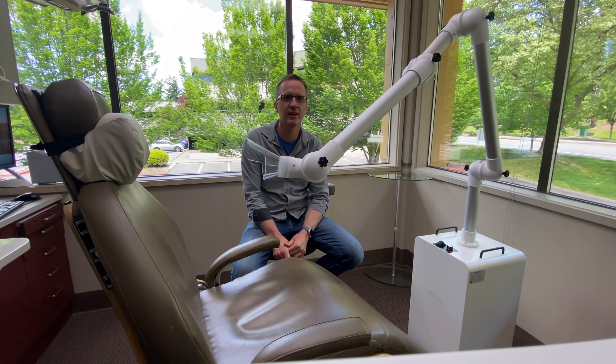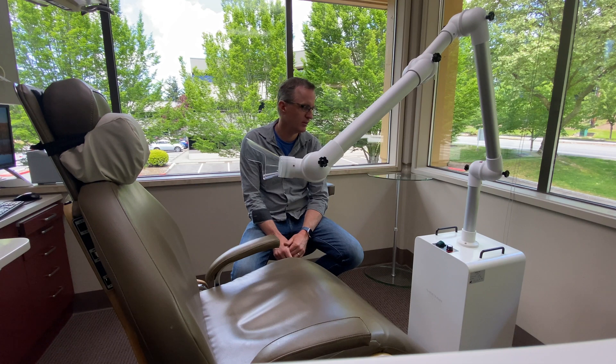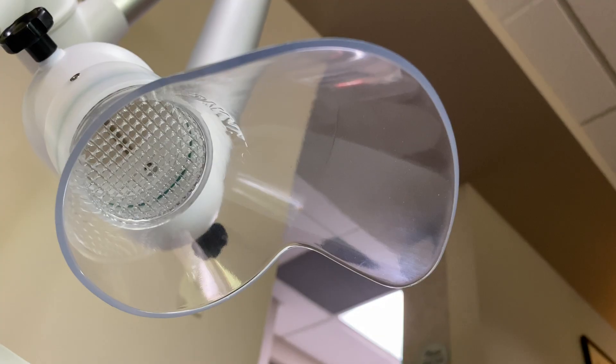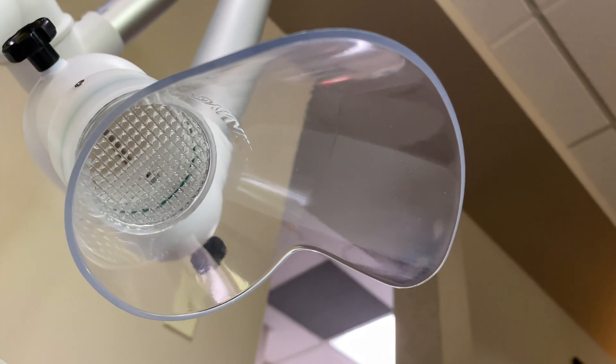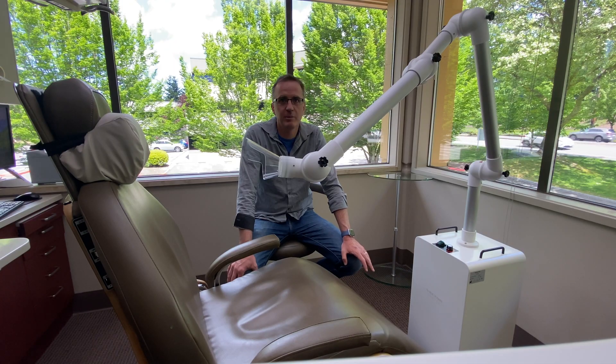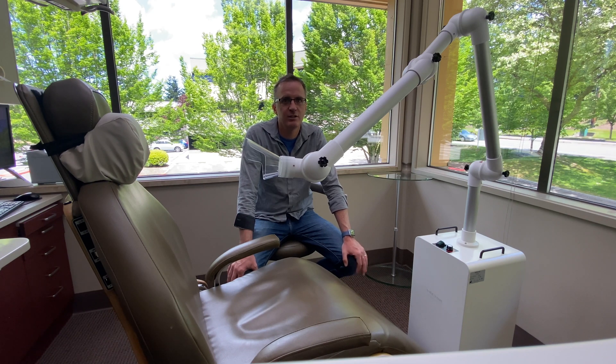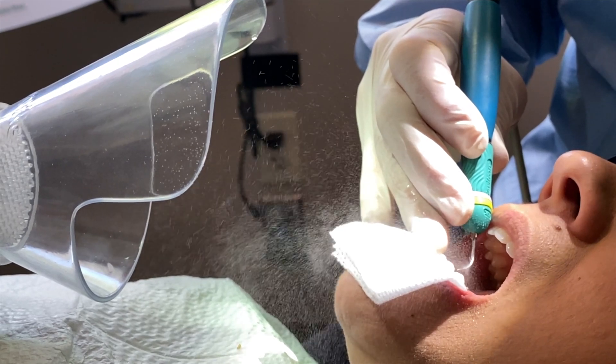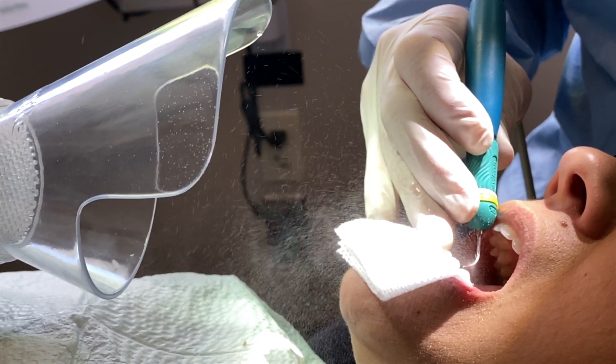My name is Casey Culberson, I'm a dentist. What we're demoing here today is the Vector Vortex extraoral suction. Aerosols are a big topic today in dentistry with this pandemic going on — patients want to be protected, dentists want to be protected, your staff wants to be protected. Hygienists using the ultrasonic scalers are scared. This will give them the peace of mind they need. This is the solution.